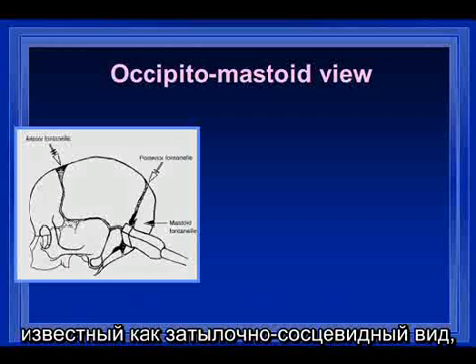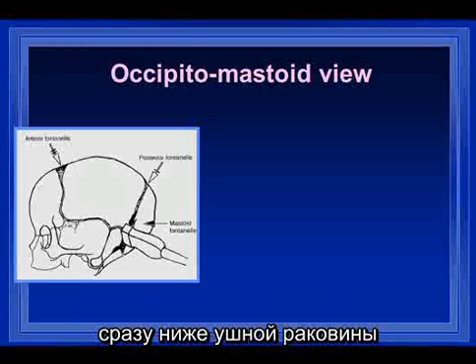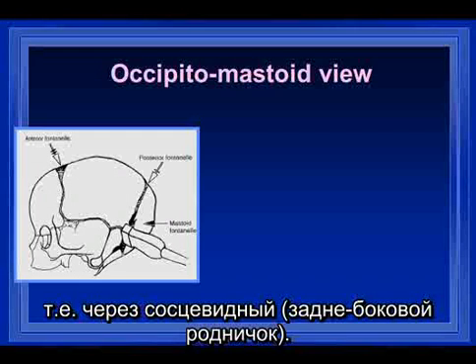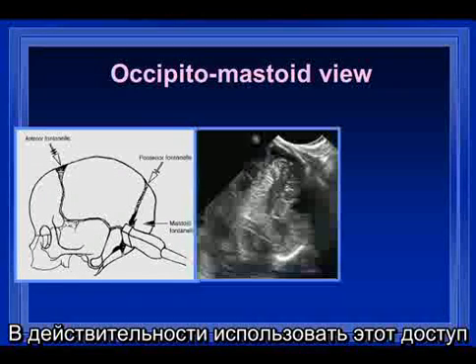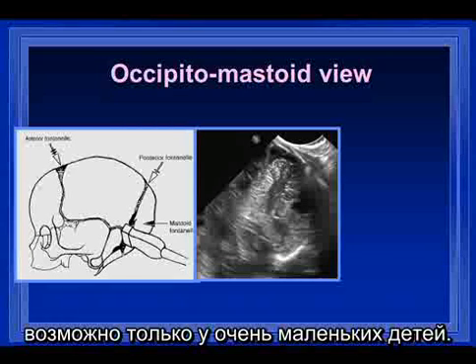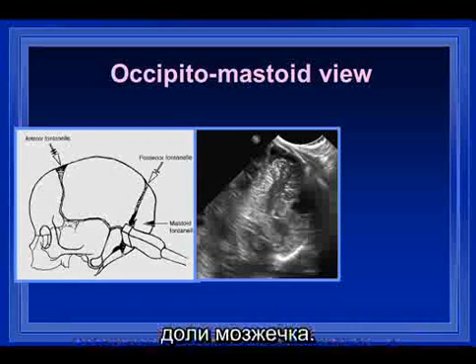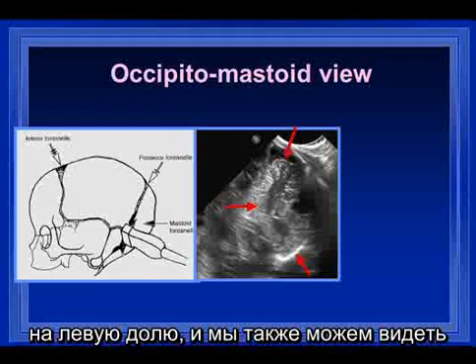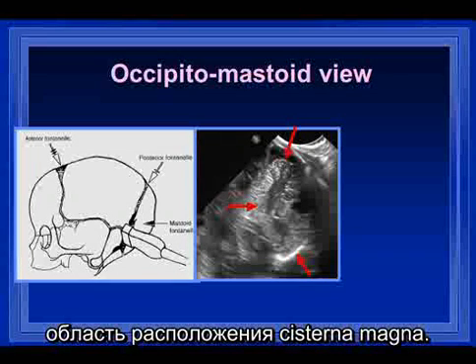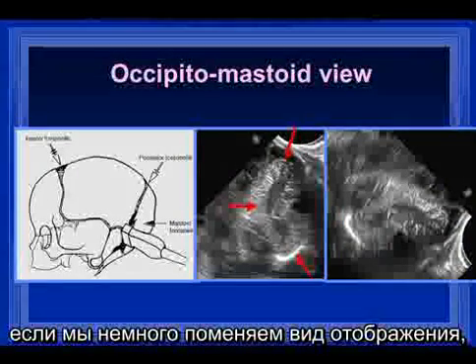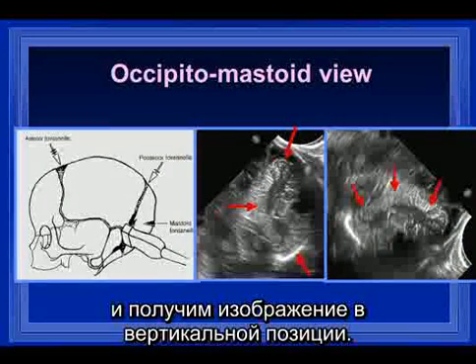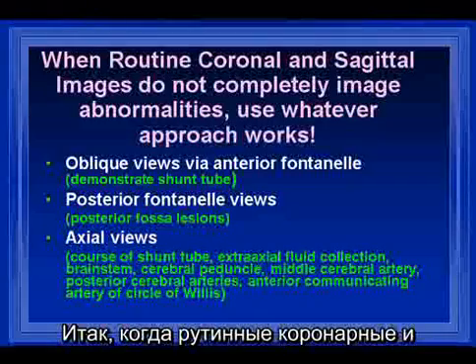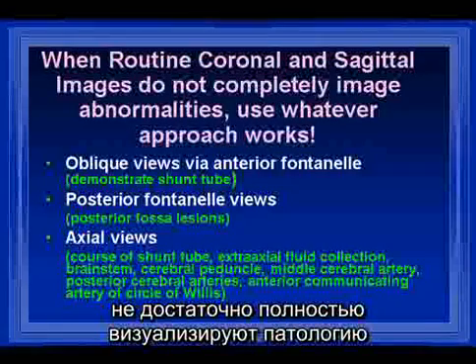Coming out a little farther laterally, we see the area of the insula. We also get another view known as the occipitomastoid view, where we use the probe right behind the ear along the mastoid fontanelle — this is only possible in very young babies. This allows us to see the lobes of the cerebellum: the right lobe, the left lobe, and the area of the cisterna magna, which is a little easier to see in a more vertical presentation.